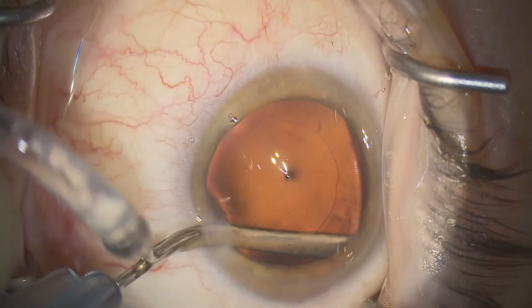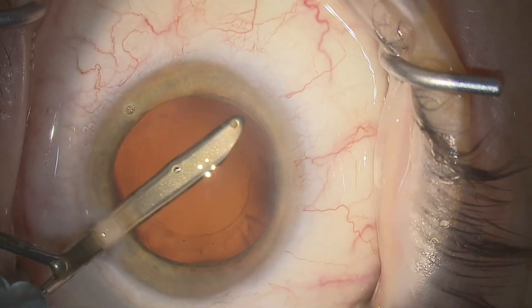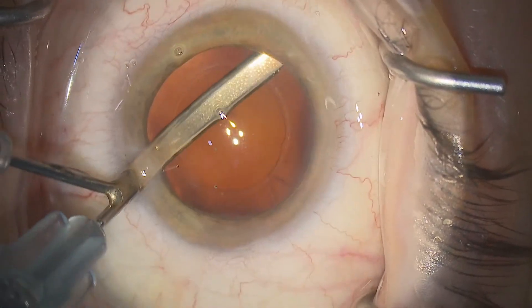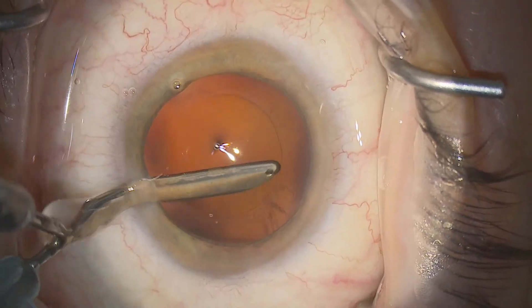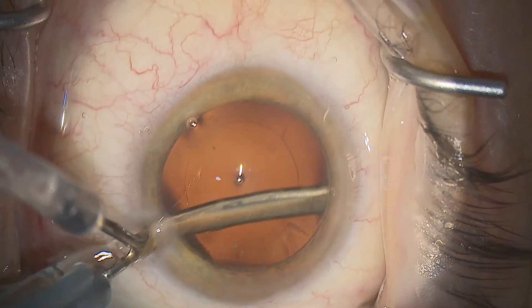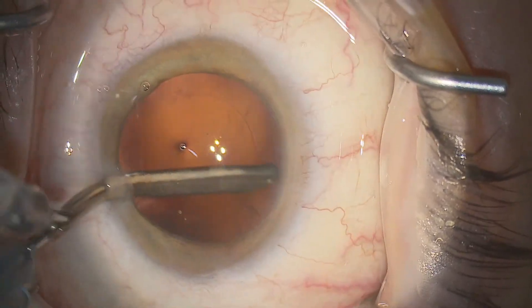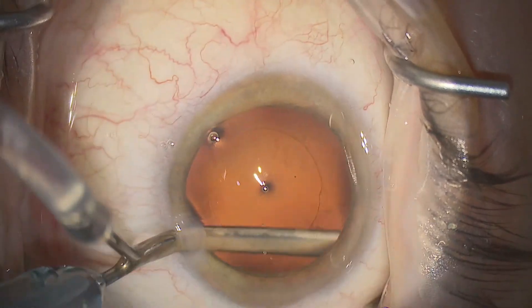We're left with this quite flamboyant sweeping motion — perfectly safe if you maintain low aspiration. This tangential sweeping motion with light aspiration is not only effective at grasping the strands of peripheral cortex, it can also be used to polish the lens epithelium. Any clinical benefit from polishing the lens epithelium is probably small, but it gives you a feel for the right level of vacuum to use.